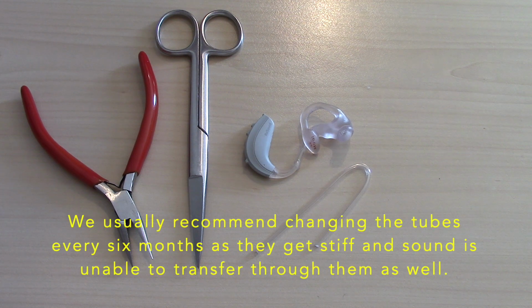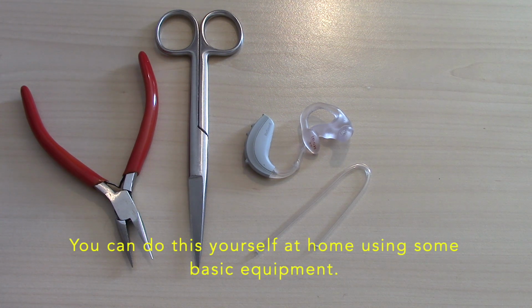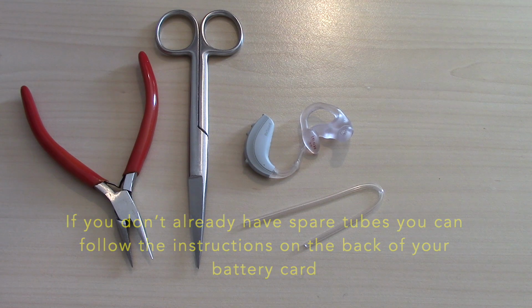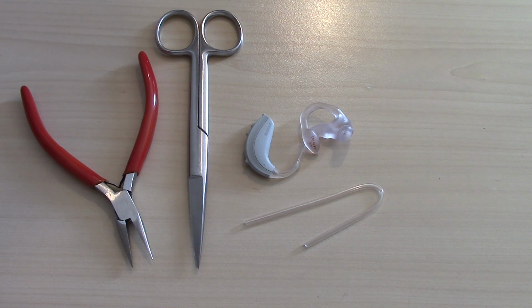We usually recommend changing the tubes every 6 months, as they can get stiff and sound is unable to transfer through them as well. You can do this yourself at home using some basic equipment. If you don't already have spare tubes, you can follow the instructions in the back of your battery card and send a note requesting new tubes and we can send them out to you.